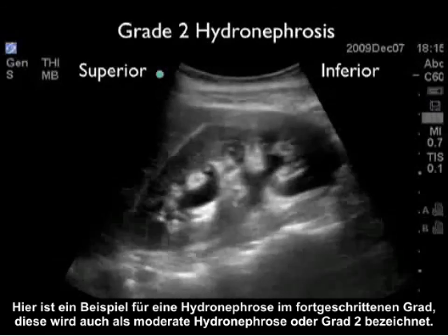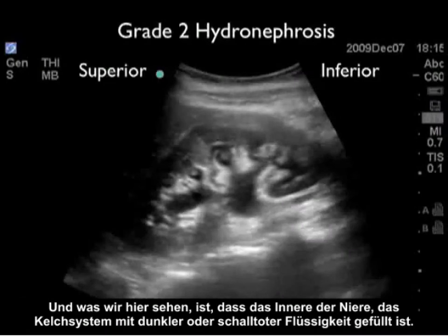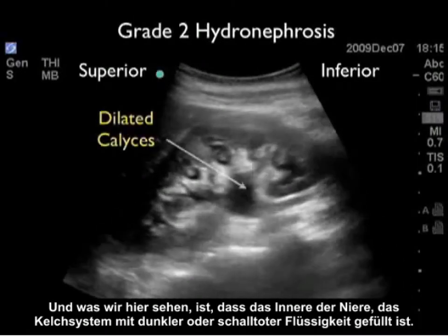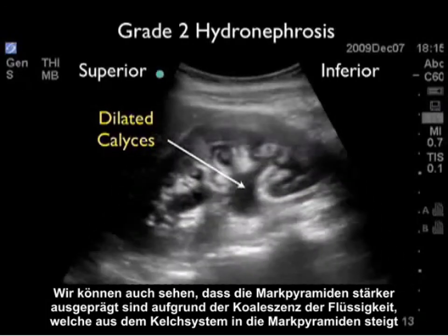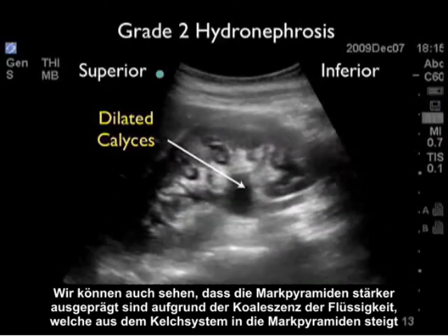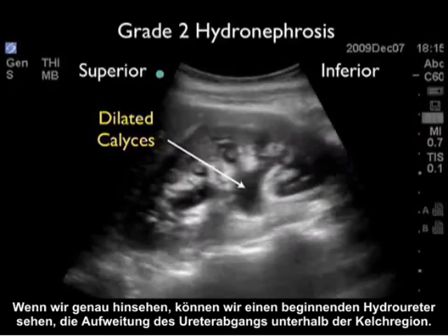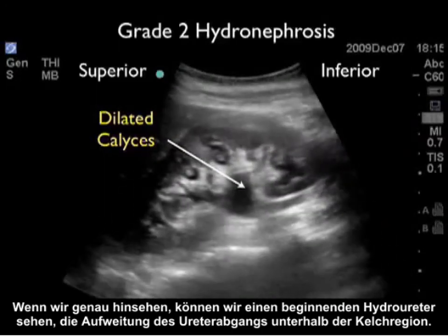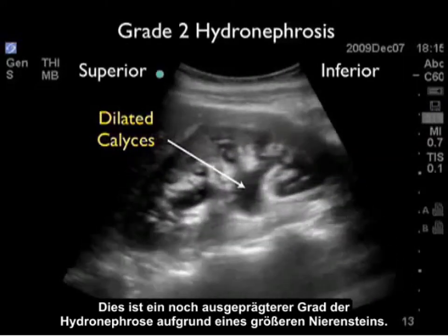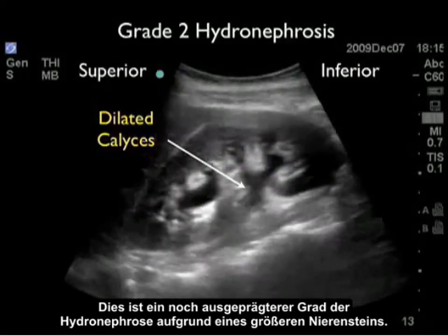Here's an example of a more advanced degree — moderate or grade two hydronephrosis. The interior of the kidney, the calyceal region, is filled with dark or anechoic fluid. We can also see that the medullary pyramids are more pronounced due to coalescence of fluid from the calyceal region into the pyramids. If we look closely, we can see the beginning of hydroureter — the ureter arching away inferiorly from the calyceal region. This represents a more pronounced degree of hydronephrosis due to a larger kidney stone.